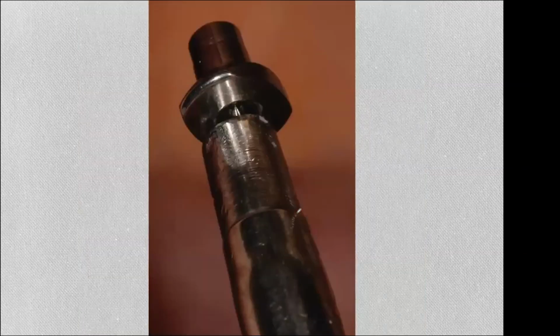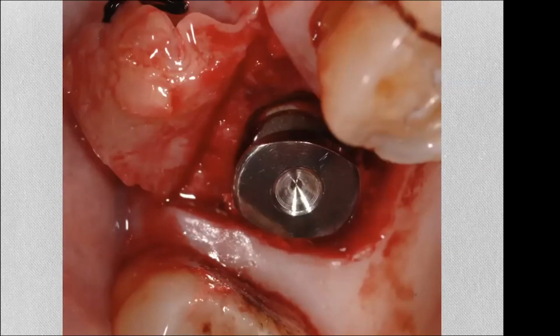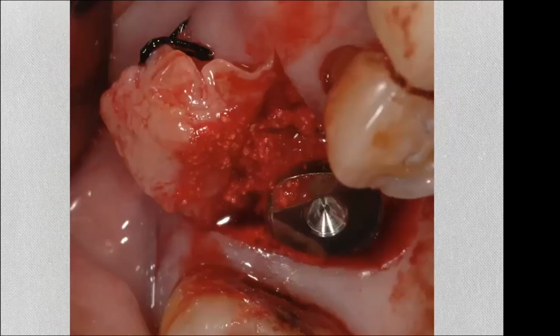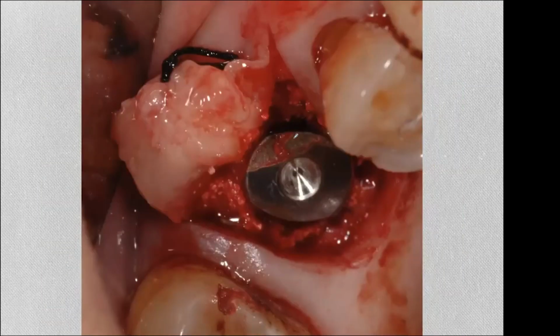So I take the sinus lift abutment. This is just the suction tip. You can hold it with anything. Now it has a 2 millimeter locking taper well in the center. You can take it with that, okay? We introduce it, and pat a little bit of bone over the shoulder. You don't have to do that, but I had so much graft. So we put that in and, okay, push the implant.